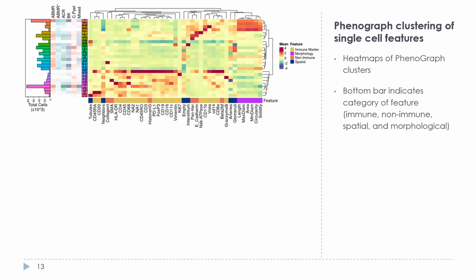So, in this example, we applied PhenoGraph clustering to identify unique clusters across all 900,000 cells of our dataset. Heat maps were then used to visualize differentially expressed features across each cluster, and that's a means of assigning biological meaning to the cluster labels. And while non-spatial single-cell modalities would be restricted to intensity-based features alone, here we can actually view morphological and renal localization features as well. Furthermore, we can view the prevalence of clusters across different disease classifications.